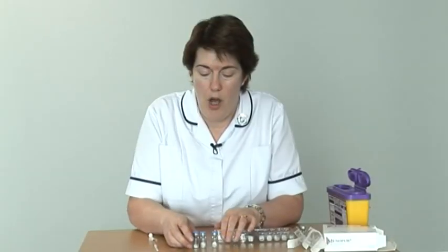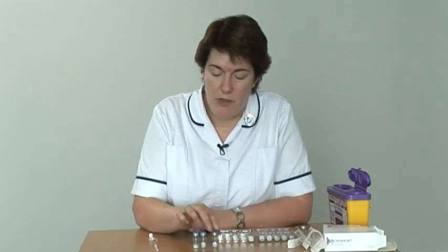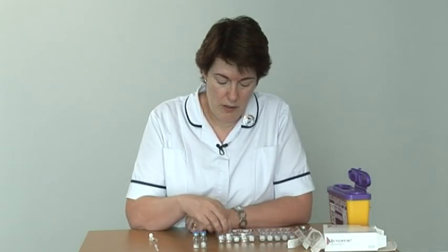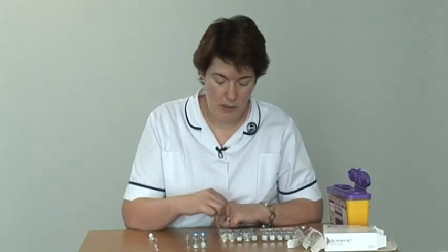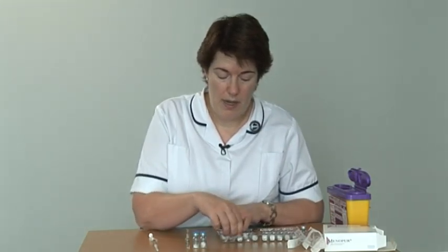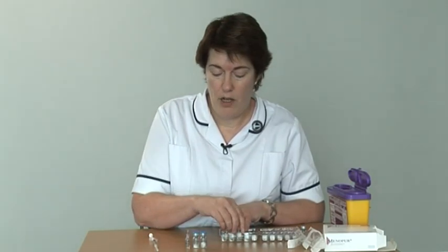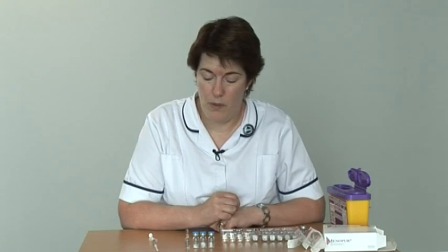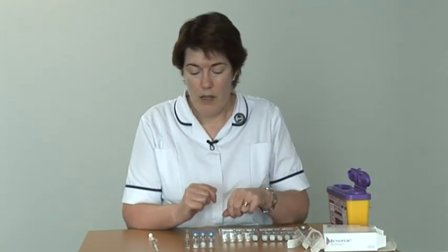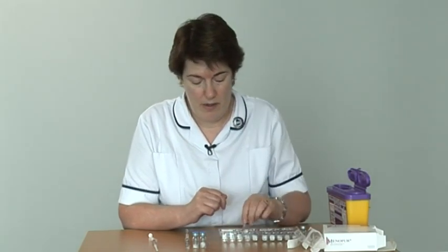Some patients will have been prescribed more than 75 units on a daily basis. If you've been prescribed 150 units, you will need to mix 2 powders into 1 diluent. If you've been prescribed 225 units, you will need to mix 3 powders with 1 diluent. The process is exactly the same as for mixing a 75 IU ampule.